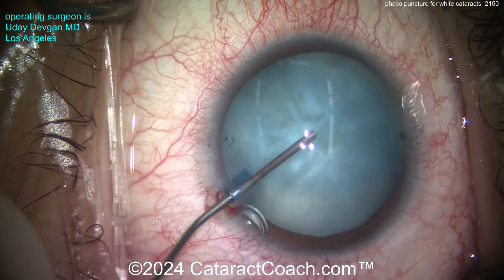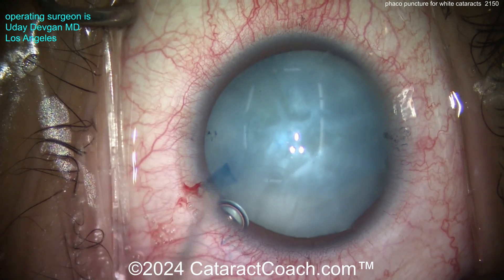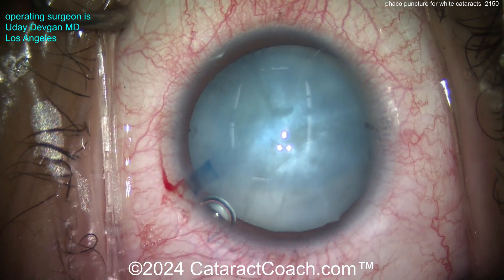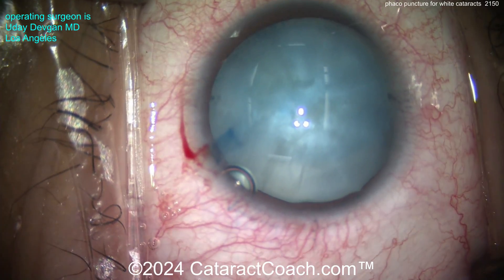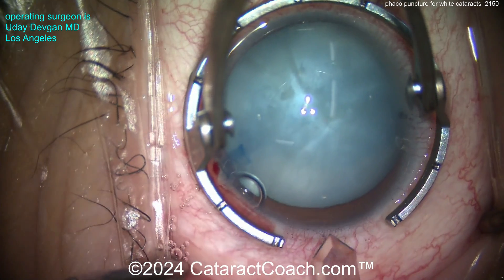The reason it's high is because of all that liquefied lens cortex — it's pressurized. So I'm injecting extra viscoelastic to really flatten out that lens capsule and get the pressure high in the anterior chamber. I want the AC pressure higher than the pressure in the capsule bag.